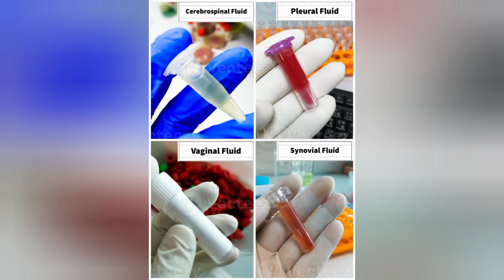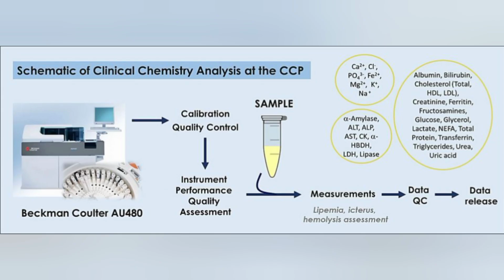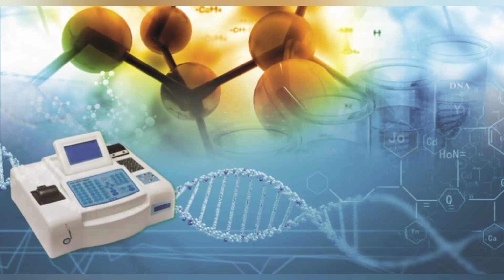Biochemical analyzers perform various tests like albumin test, sugar level test, or to detect levels of enzymes and creatinine in the blood. So the benefit of the biochemical analyzer is that it has made it possible to detect and monitor diseases by analysis of chemical reactions and biological processes taking place inside the patient's body within less time. So it is a great tool in the research area too.